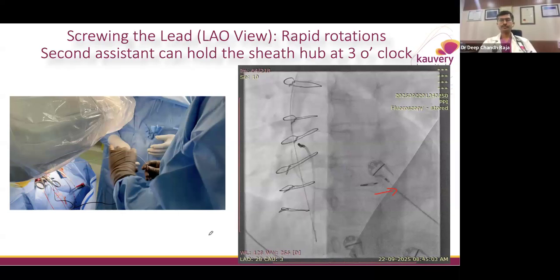Okay, so I'll take question number two. With a stylet-driven lead, when it has gone past the interventricular septum into the left ventricular cavity, as I mentioned, we never try to place the lead back into the septum because we have already created a burrow there, and there's a high chance that if you leave the lead in the same burrow, it might dislodge after the case or in the following days. So we never leave the lead at that particular location if we have perforated into the cavity. So question number one, how do we know that we are past?